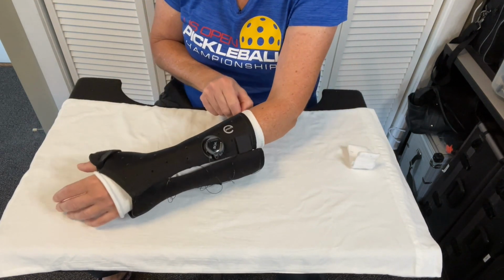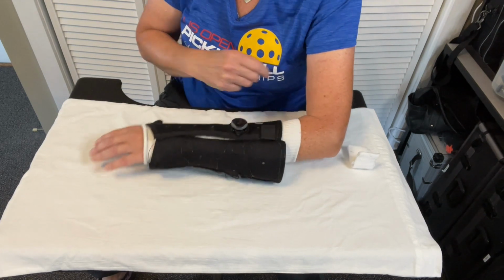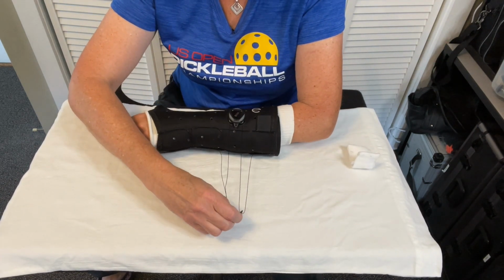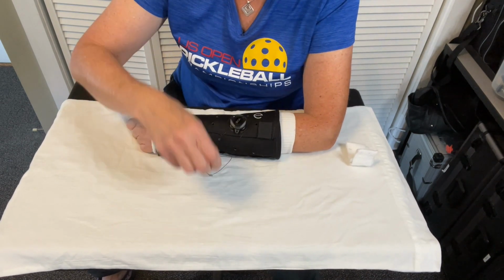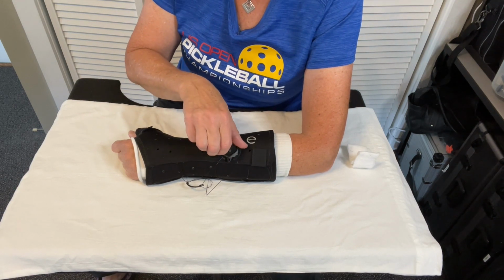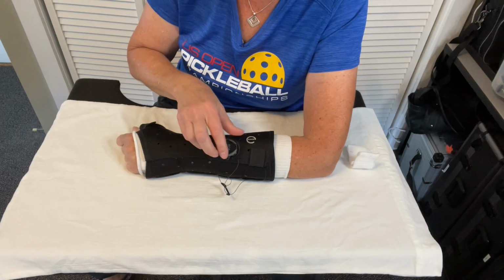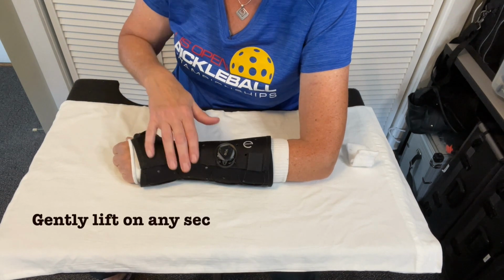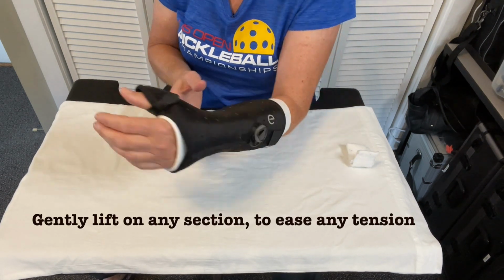Just like that. Then you take this little half moon and slide it back till it's even, and then push it down and then slowly tighten it as such. So you can tighten it to where it's comfortable, just like that. And if you need to, you can loosen up just the front portion a little bit.